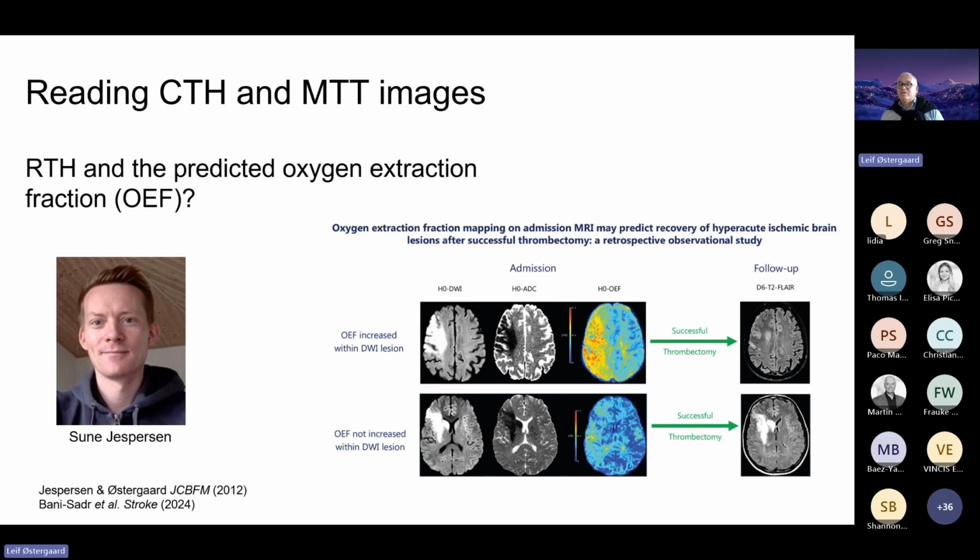And I want to tell you something you should be aware of here: we measure what OEF could be if cells were using oxygen at the rate that it's provided to them by the microcirculation. So this could well be the actual OEF you would measure if you had a PET scanner in the top, and the same for the bottom, when you're just lacking capillaries, and so OEF is not very high. But really, it is that biophysical.